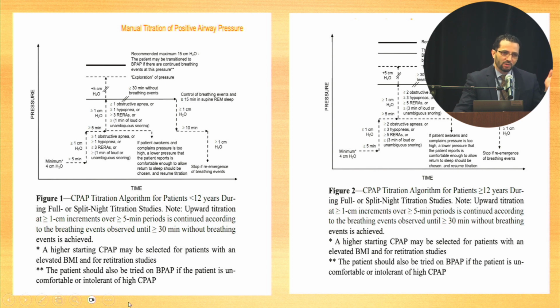You can go up, but don't go up more than 5 centimeters of water, and this is a consensus from our expert opinion. Again, you can go down, and down titration is also allowed. You don't have to do that, but you could do that to find the minimum pressure needed to eliminate the events.